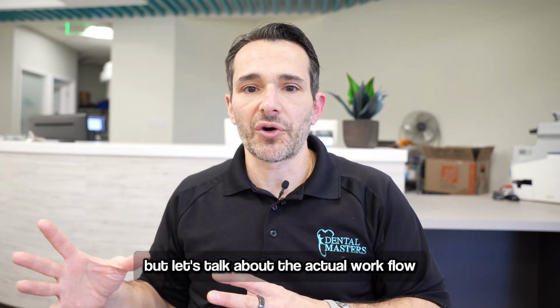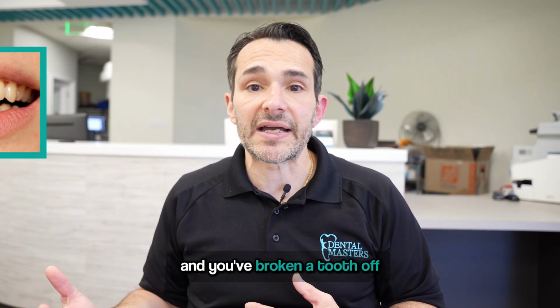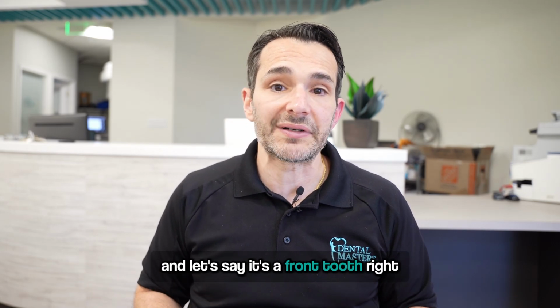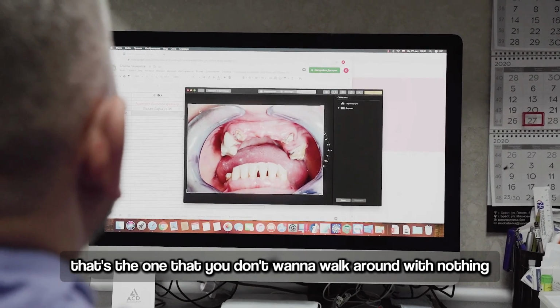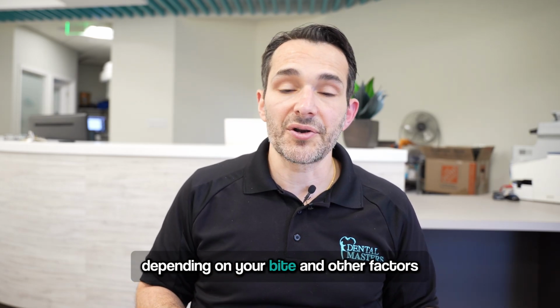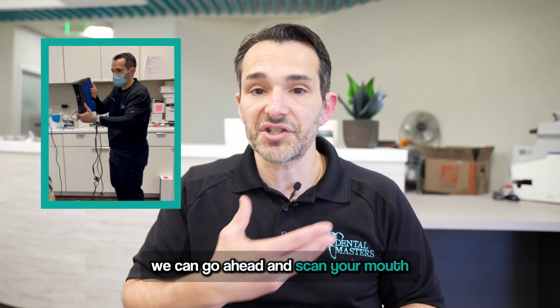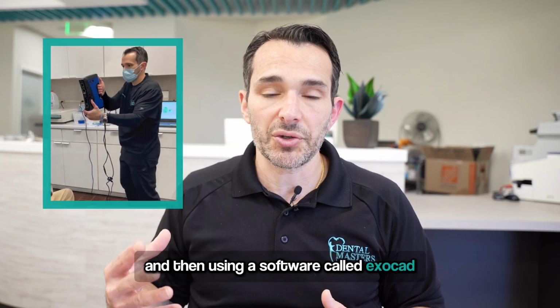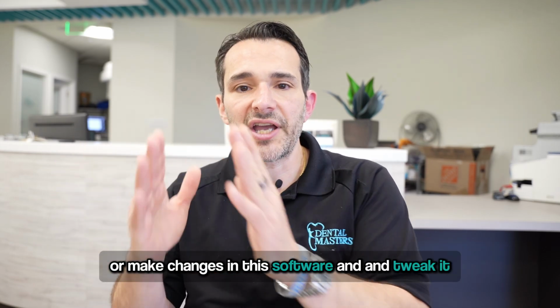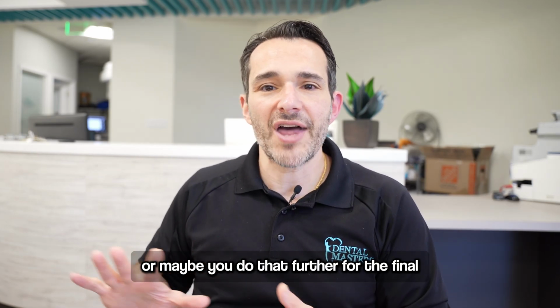But let's talk about the actual workflow from a digital dentistry and laboratory standpoint. So you come in, this is an example, and you've broken a tooth off, and we're going to place an implant, and we need to now find a way to put a tooth in. And let's say it's a front tooth, right? That's the one that you don't want to walk around with nothing. Now, of course, it does vary from patient to patient depending on your bite and other factors, but using the digital dentistry and in-house lab workflow, we can go ahead and scan your mouth, and then using a software called exocad, and there's some other ones, we can actually take that and duplicate the other tooth if we like that, or make changes in this software and tweak it, and you can actually look at it if you'd like, or maybe you do that further for the final.